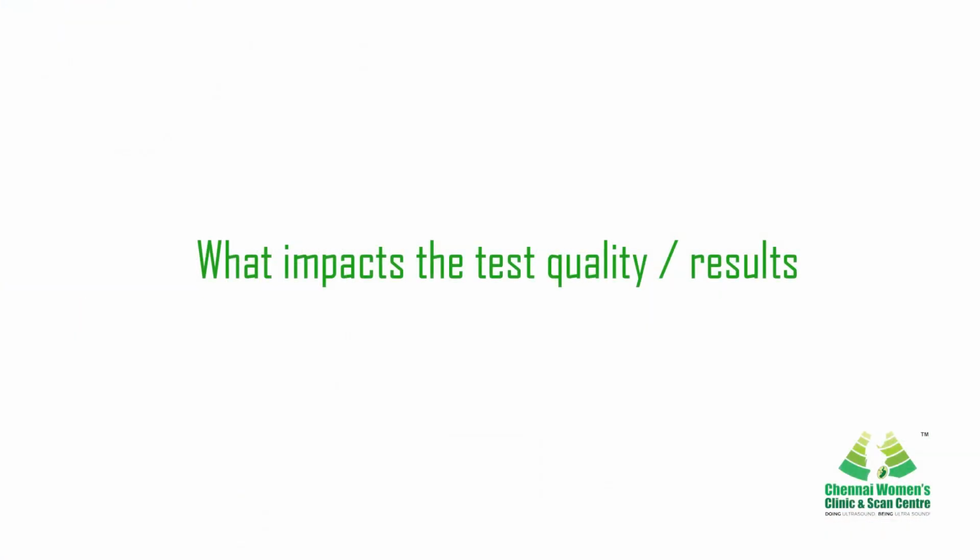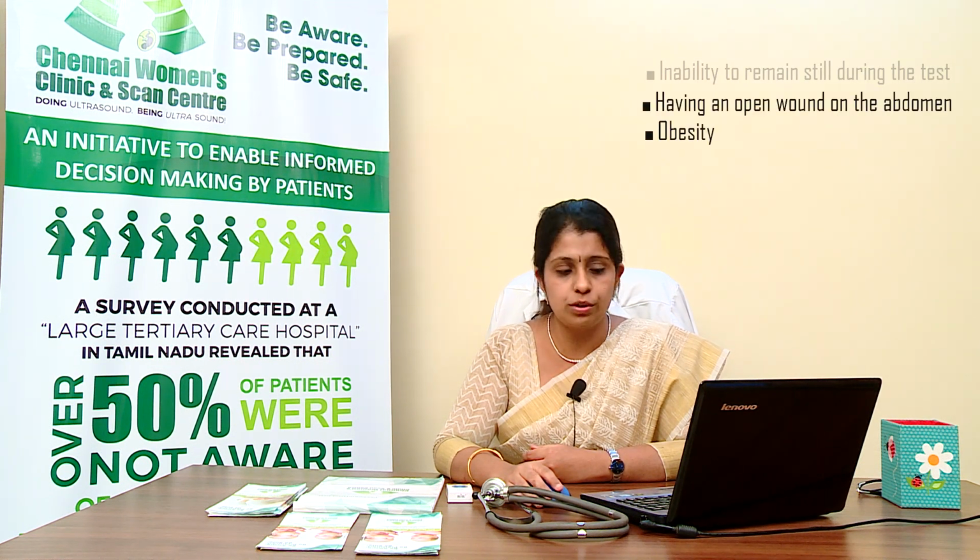What impacts the test quality or results? The reasons a patient may not be able to have the test or why the results may not be helpful will include the presence of stool, air or gas in the intestines or rectum, inability to remain still during the test, obesity, or having an open wound on the abdomen.